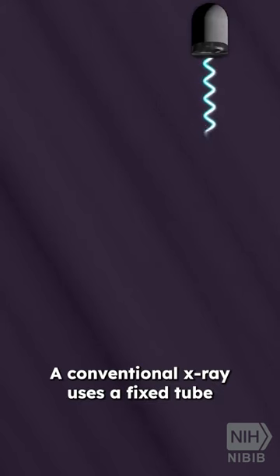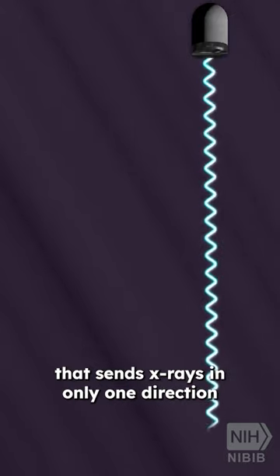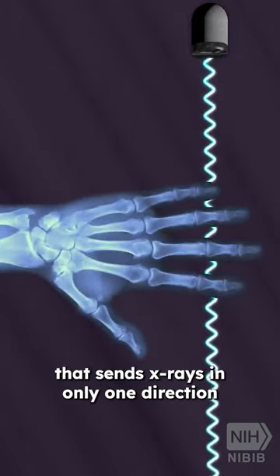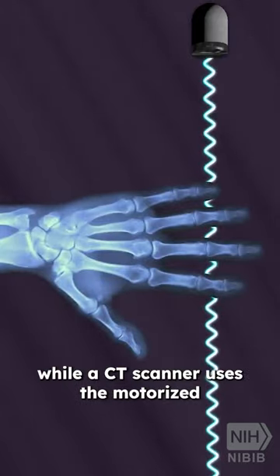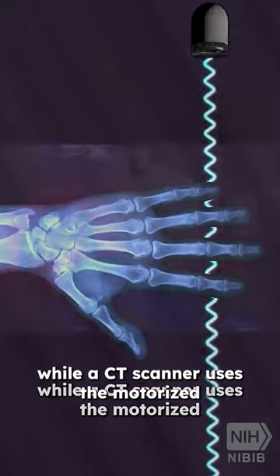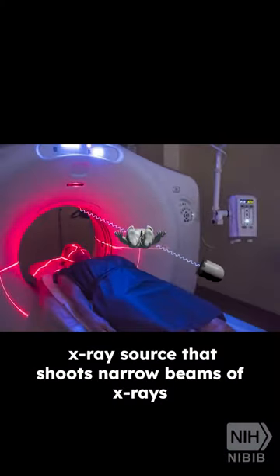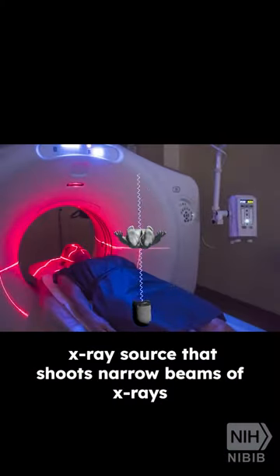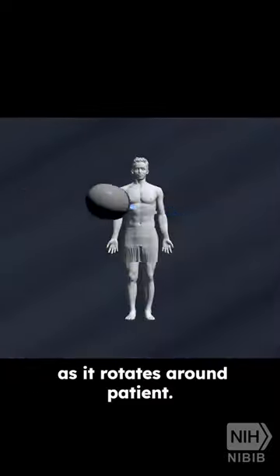A conventional x-ray uses a fixed tube that sends x-rays in only one direction, while a CT scanner uses a motorized x-ray source that shoots narrow beams of x-rays as it rotates around the patient.